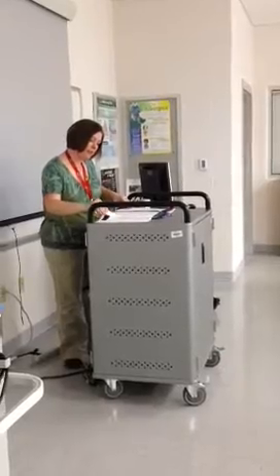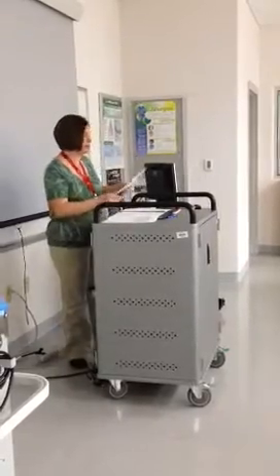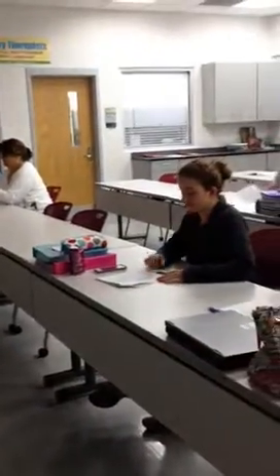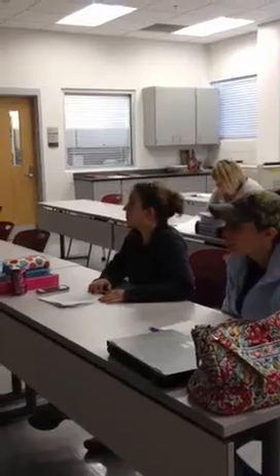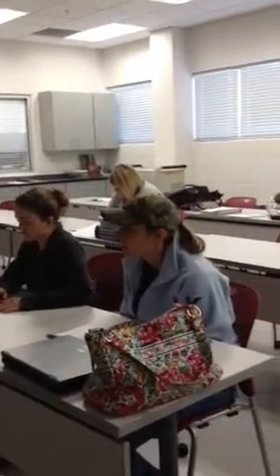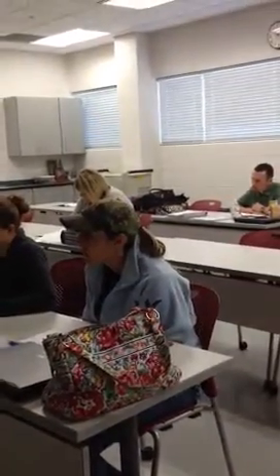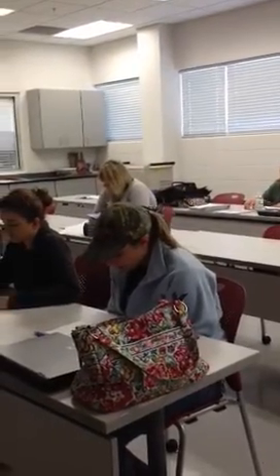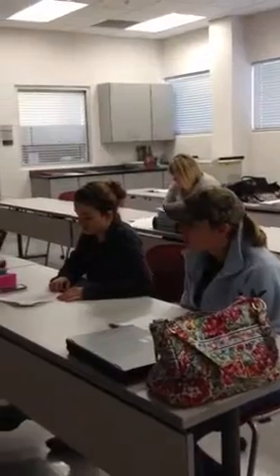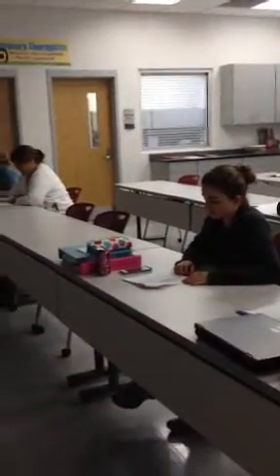Okay. Then the next picture you got in there, I believe, is the picture of the arm. The arm shows your radial artery that we palpated in the Allen's test and the ulnar artery. It's just showing you where those arteries are and how they run together down in the hand, because you don't want to stick the ulnar artery. You want to stick the radial. So I was just showing you a picture of exactly where to stick.